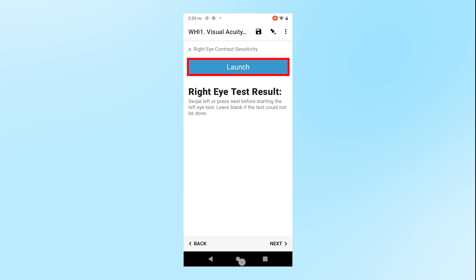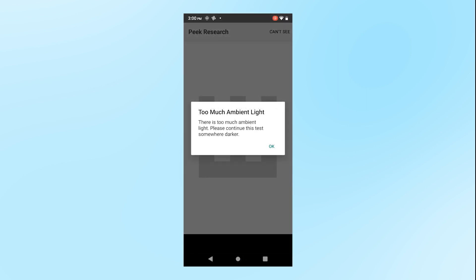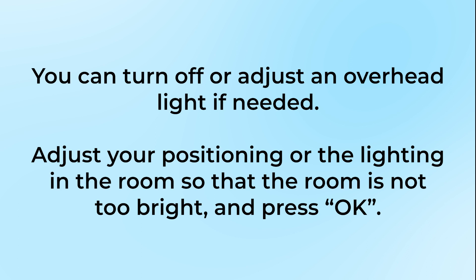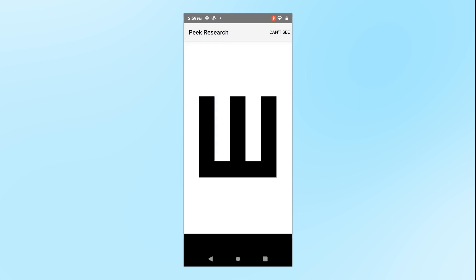When you are ready to begin the screening, select the Launch button to start the Contrast Sensitivity Screening. If there is too much light in the room, a message will pop up that says: there is too much ambient light. Please continue this test somewhere darker. You can turn off or adjust an overhead light if needed. Adjust your positioning or the lighting in the room so that the room is not too bright, and press OK. At this point, confirm that you see a large letter E on the phone. You are ready to begin the Contrast Sensitivity Screening with the participant.